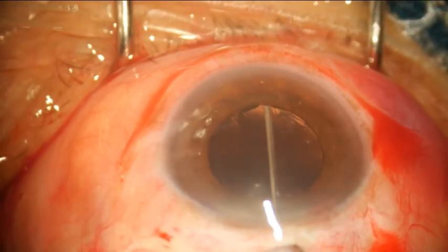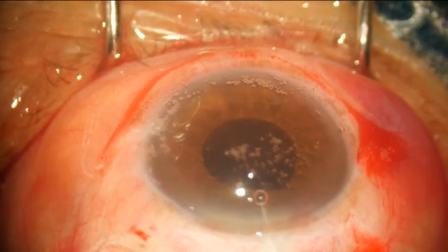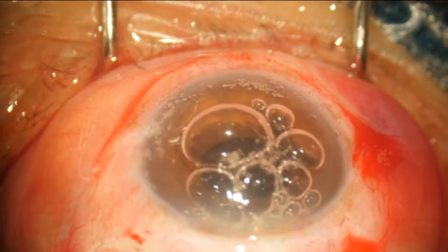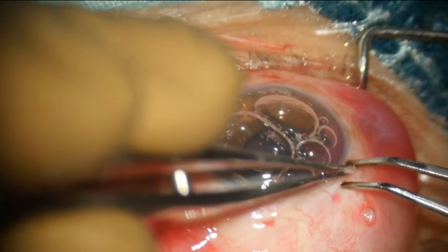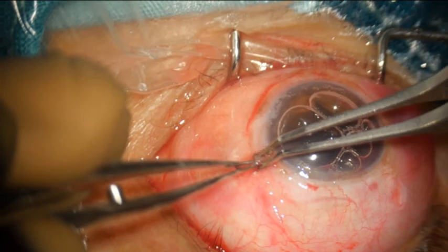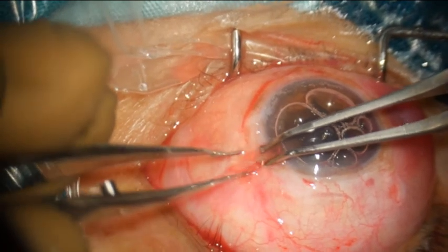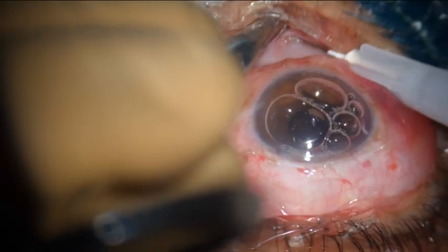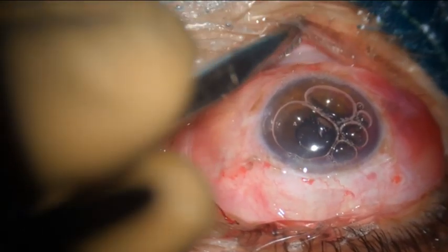After IOL placement, I normally wash out the residual cortex and clean under the IOL to remove extra visco. Air is put in to form the chamber, and then the edges of the wound are lightly cauterized to close the scleral wound well. Finally, subconjunctival dexamethasone is given, lifting the lower lid.